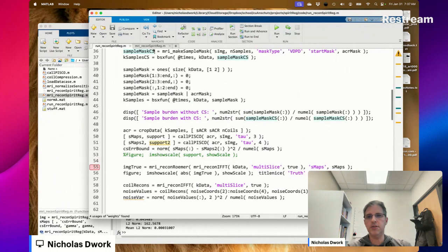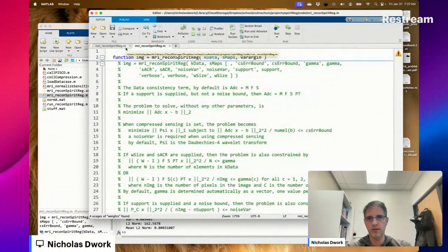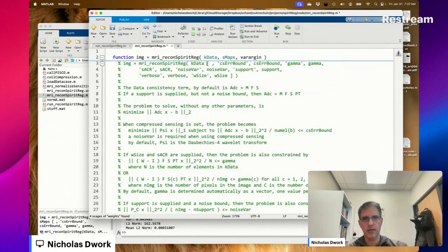The first step to joint sparsity is making this work for just a single coil. So I think S maps now is going to be an optional parameter.